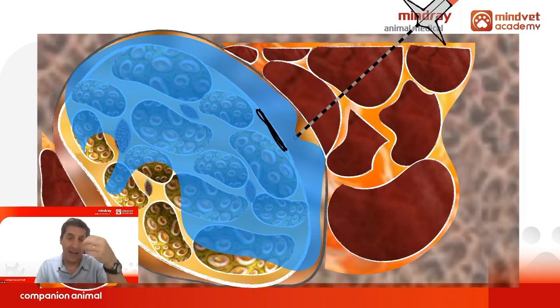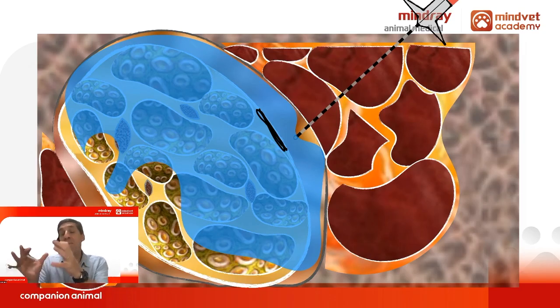And that is, again and again, a good reason to introduce tools that allow us to see the tip of the needle, the belly of the muscle, and the nerve itself.